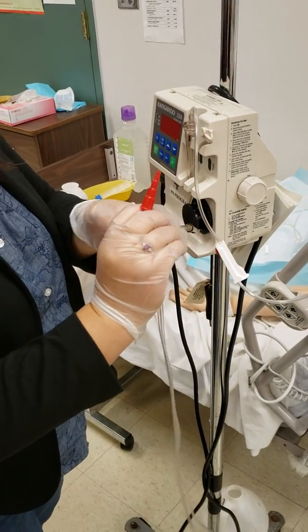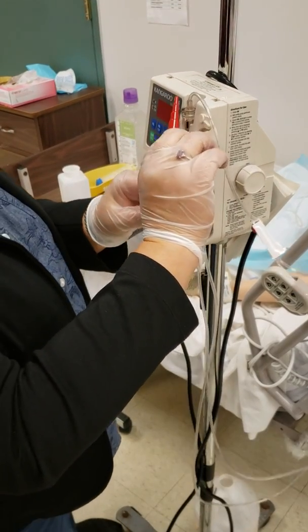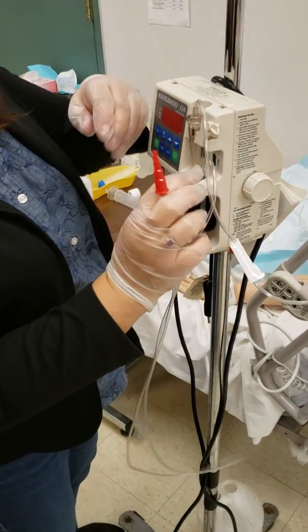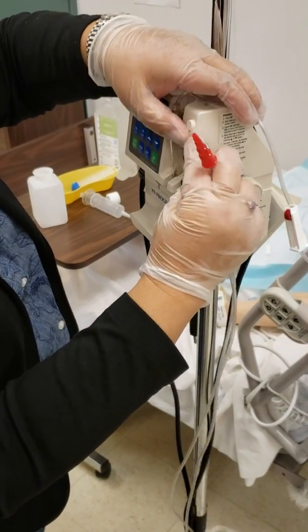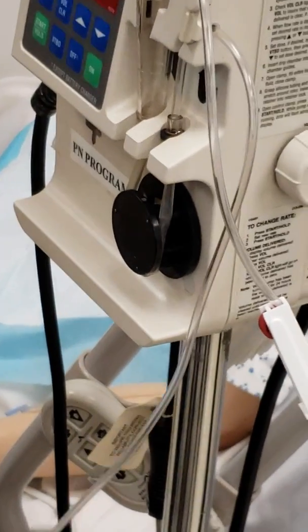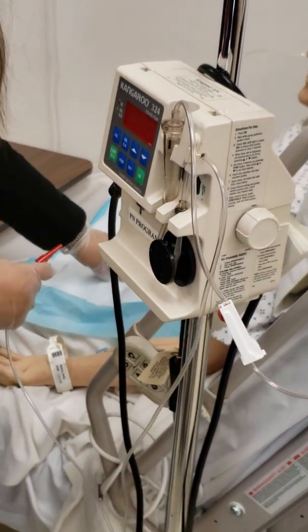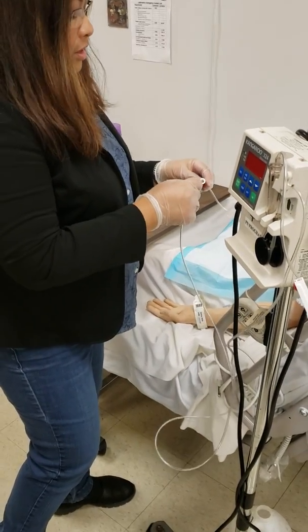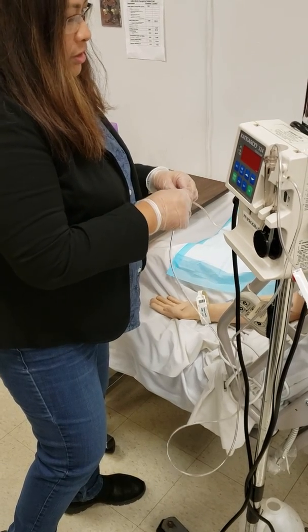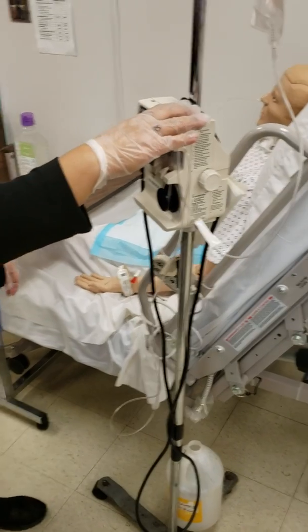And then make sure that this metal here is all the way up there. And then this one we put over here and close it. Alrighty. Okay. So we can wipe this. You can open it and wipe it with alcohol, and then we will attach this over here. And then we will turn this on.